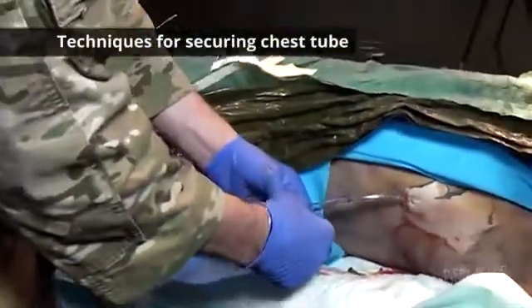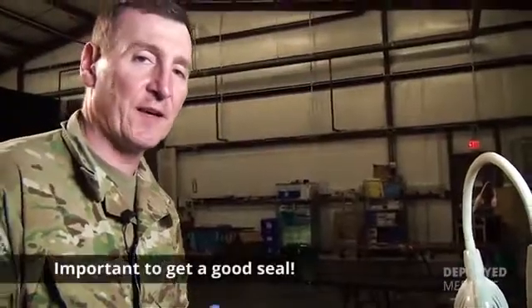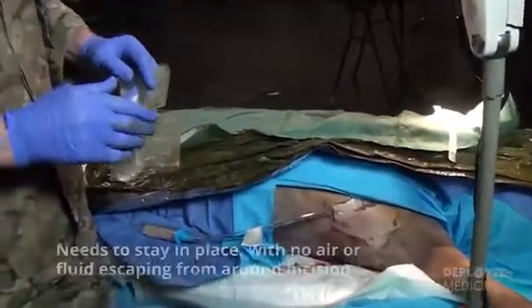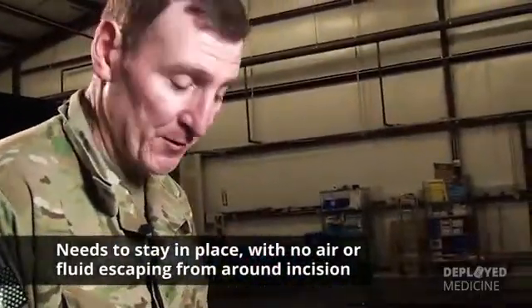All right, there are a lot of different techniques for securing your chest tube. The important thing is that you get a good seal on it and that it's not going to come out and you don't have any air or fluid escaping from the chest.